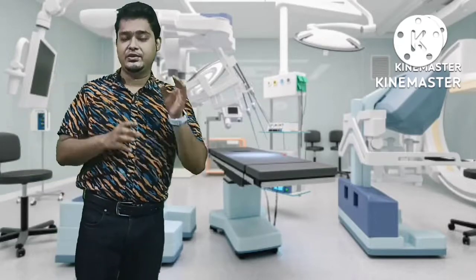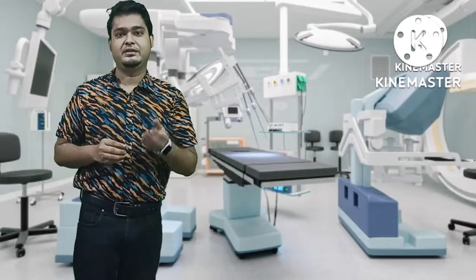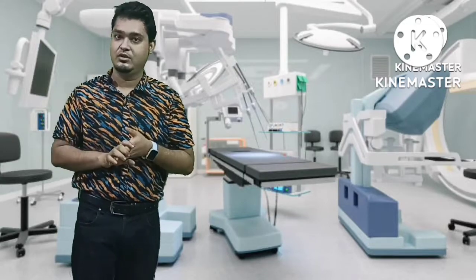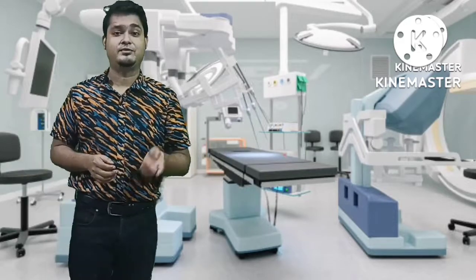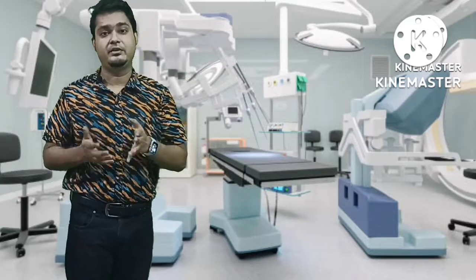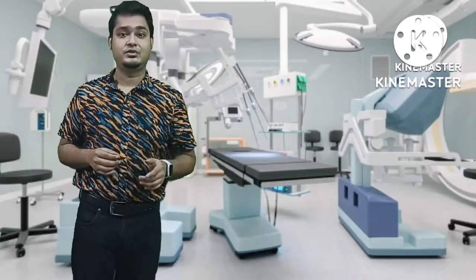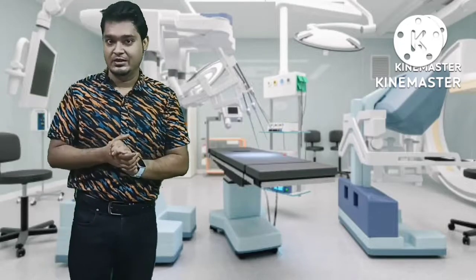CT coronary angiography is basically a day care procedure, meaning the patient just comes, we prepare him and perform the examination. The patient can easily go home or return to daily life and activity. But for catheter angiography, the patient has to be admitted first. Then after admitting the patient, we prepare the patient and take the patient to the cath lab, and there we do the invasive procedure of catheter angiography with the insertion of a catheter.